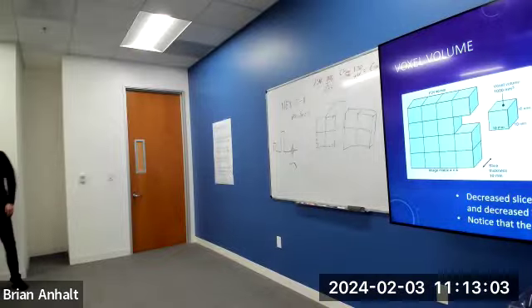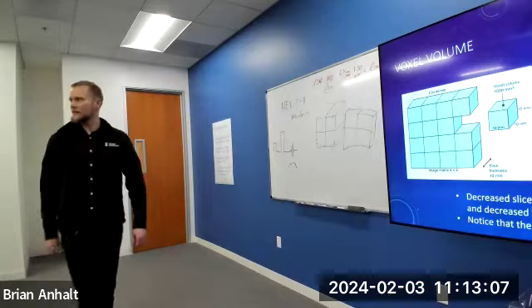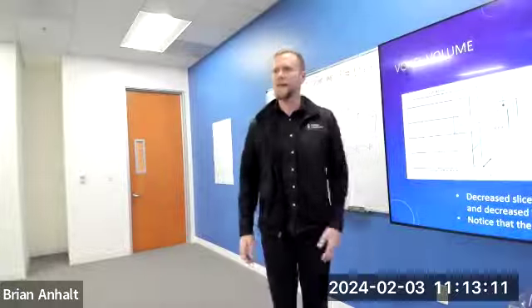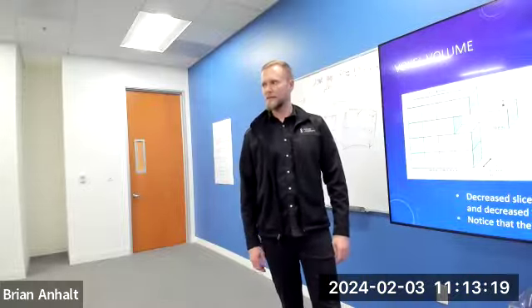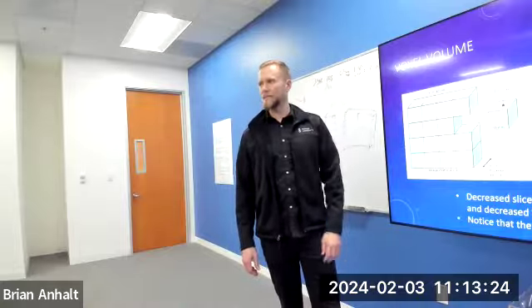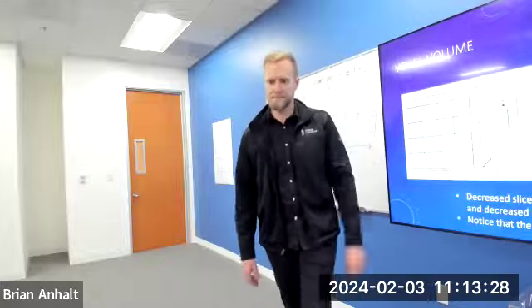So it is a linear relationship here, right? Voxel size and SNR is a linear relationship. If I halve my voxel volume by halving my slice thickness, I have half the SNR. And vice versa. If we double the slice thickness, we get double the SNR, because we have double the voxel volume, right? Nothing else changed. Field of view stayed the same. Matrix stayed the same.